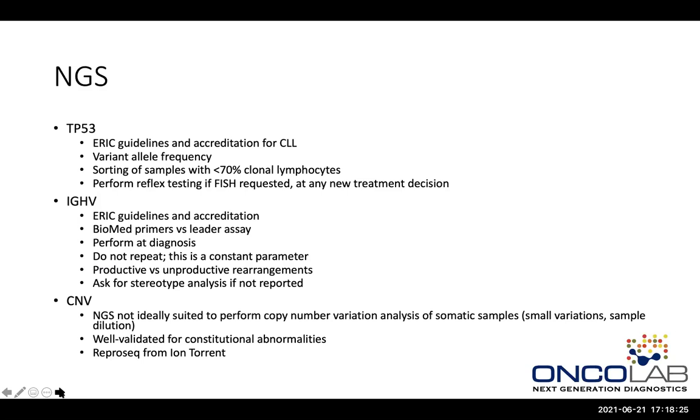Okay, so sorry, TP53, we look at the variant allele frequency here. As per ERIC guidelines, we do not report on anything less than 10%.